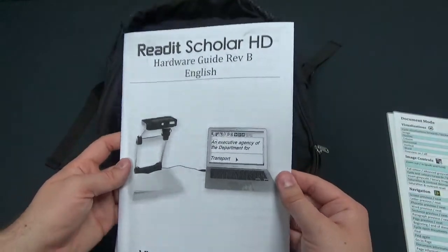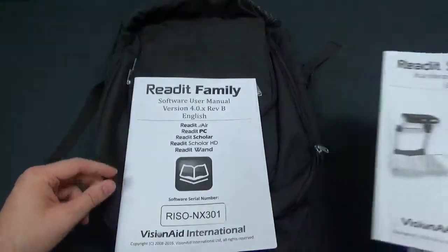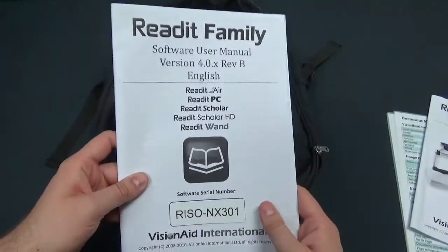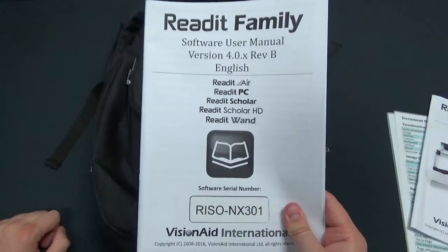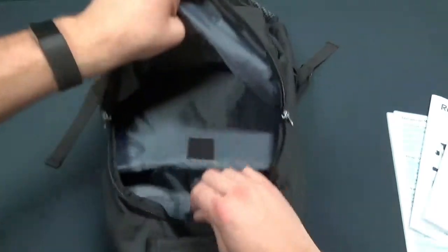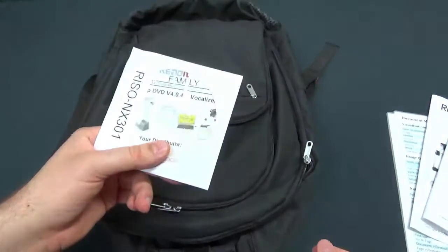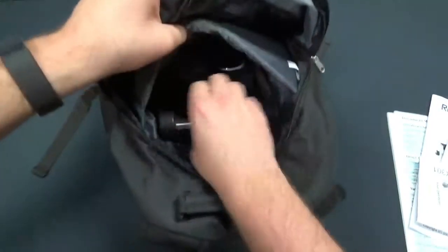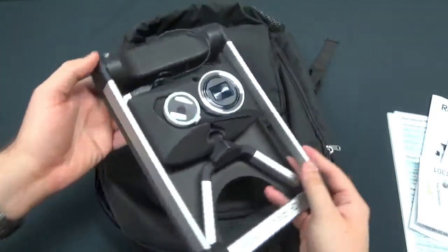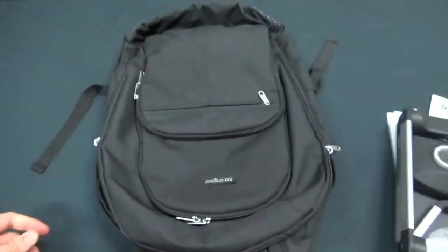Here's your Scholar HD hardware user guide, so anything and everything you need to know about your actual Scholar HD itself will be inside there. And here's your user manual for the ReadIt software, which is going to be powering your Scholar HD, so everything you need to know about the ReadIt software will be inside there for you. We also get an installation CD here for your ReadIt software, and there is our Scholar — all collapsed up just like that, nice and compact, very lightweight.